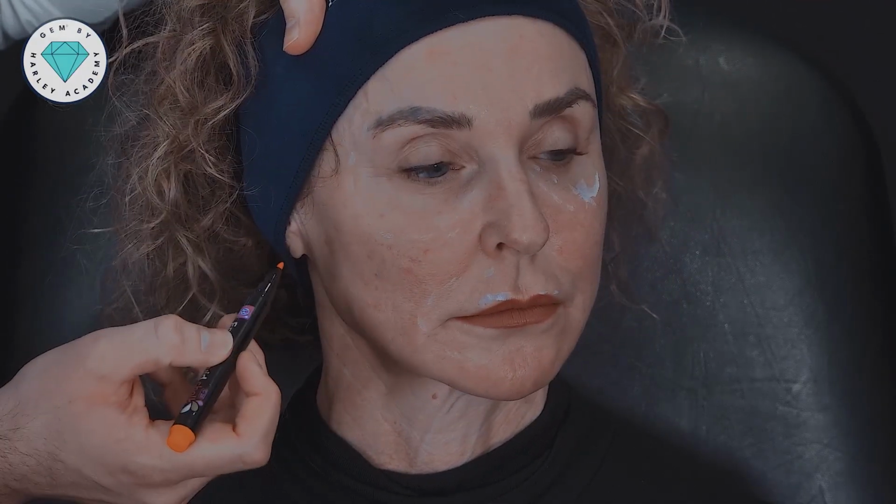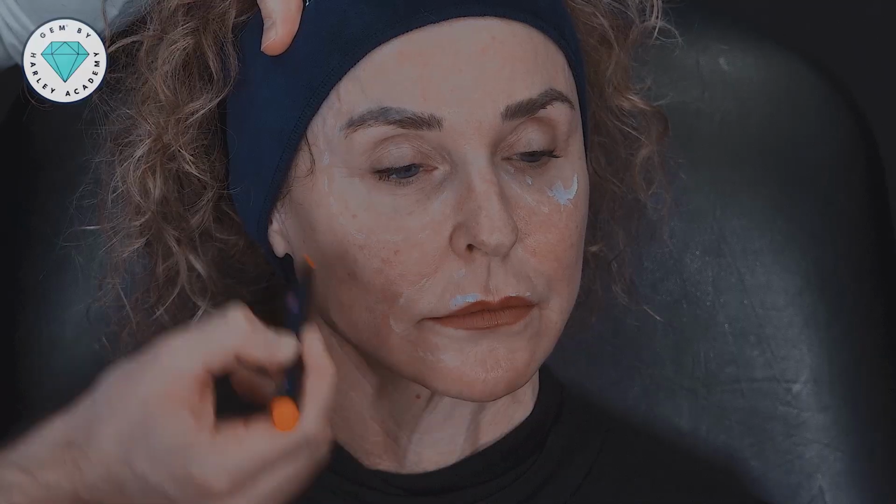So in Emily's case, as we see in many patients who have had filler over the years, we have these characteristic signs, and I'm hopeful that with some hyaluronidase today, we can reduce the appearance of the unwanted filler. The second area that I want to treat with hyaluronidase is the medial cheek. And this is, I would say, the most frequently overfilled zone of the face, particularly with patients that have had filler over time.